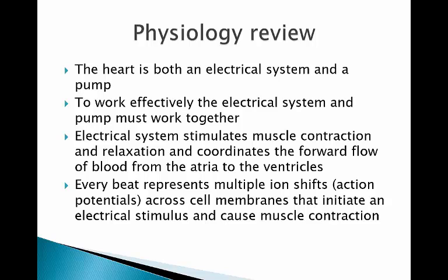All right? Obviously, we have talked about the pump before when we talk about cardiac output and congestive heart failure and those types of things. But it is also an electrical system. So that is what is represented on the telemetry strip and on the monitor that you see.